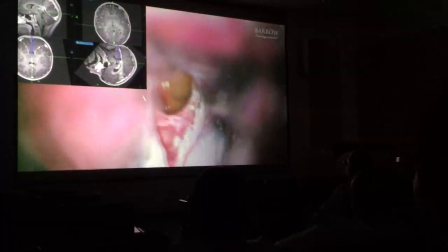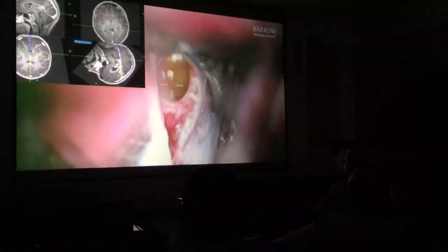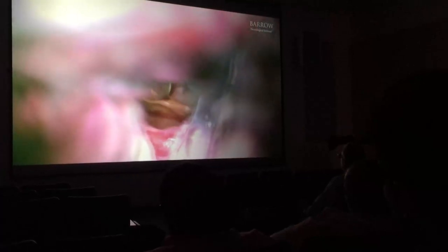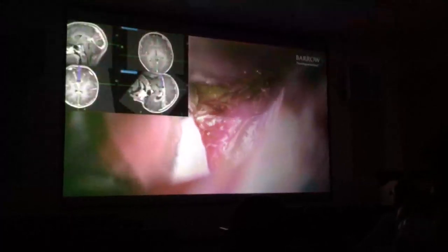Remember that it had a fluid level on it? You can see the hemosiderin staining, especially higher up. And now you can see where the hemorrhage had occurred previously. Then you really just go circumferentially around the lesion. This was a cyst with a hemangioblastoma. The usual technique of gentle traction using your sucker also as a tool for resection, and then finally taking the lesion out.